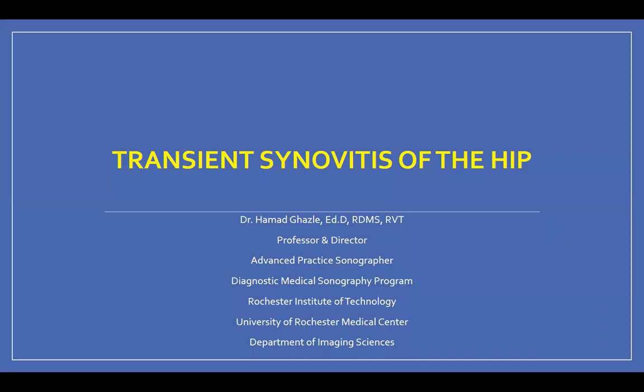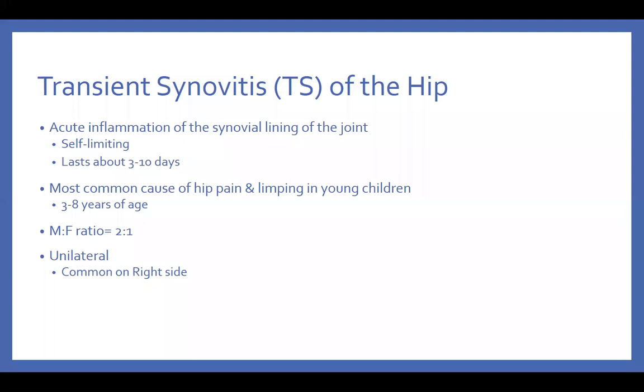Thank you so much for joining me today to talk about transient synovitis of the hip and the role of sonography in the evaluation and diagnosis of transient synovitis.